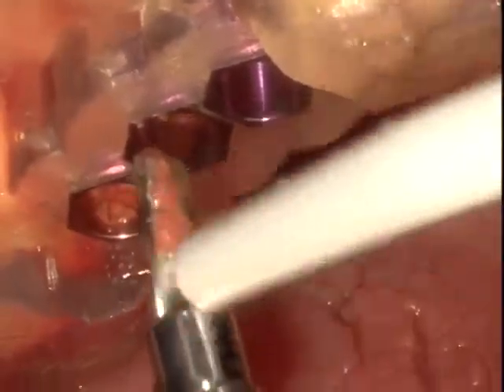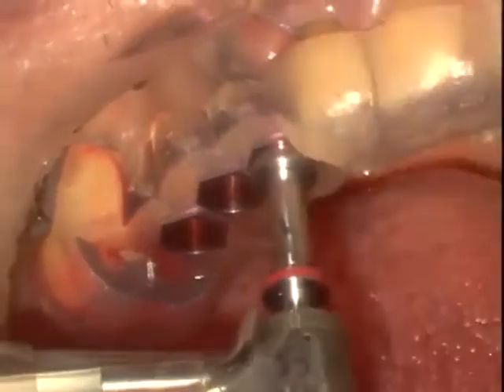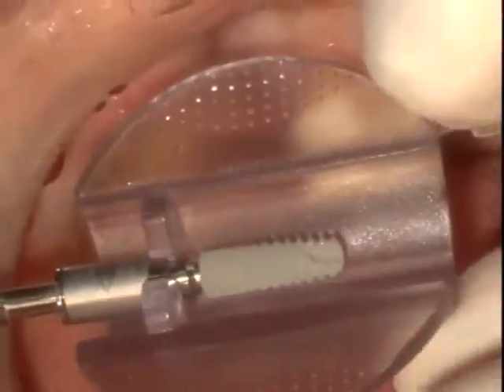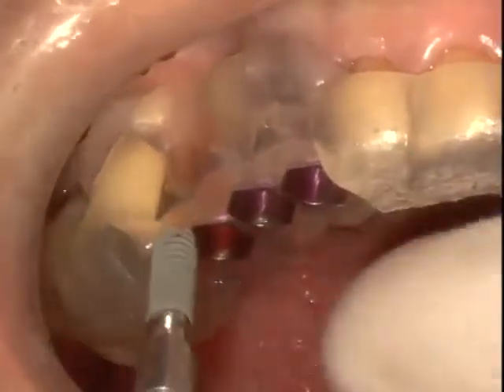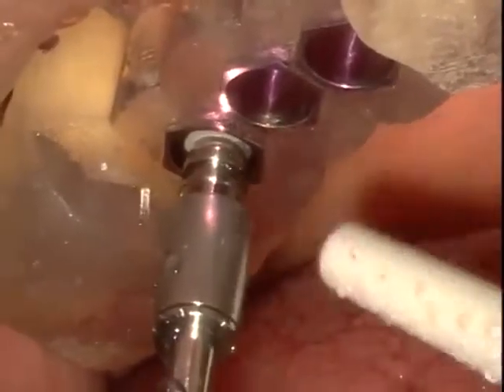We go ahead, you can see the bone being taken out through the trephine. We recognize that the drilling is based upon what we've already treatment planned on the computer. The sleeves fit, and you can see how simple the drilling is in both the extraction site and the previously extracted ridge sites. An Ankylos CX implant, microtextured to the top and over the top of the implant, is now going to be utilized. We're going to be utilizing the 3.5 millimeter diameter implants.